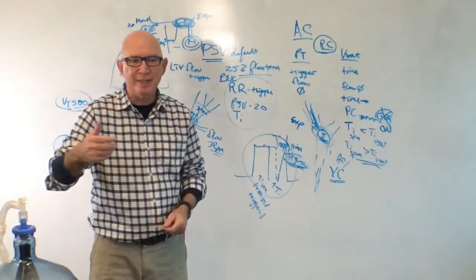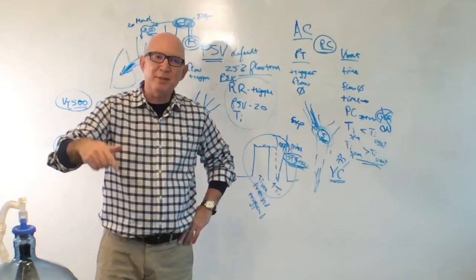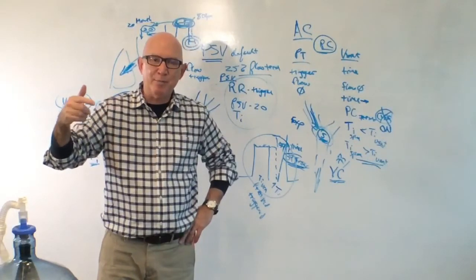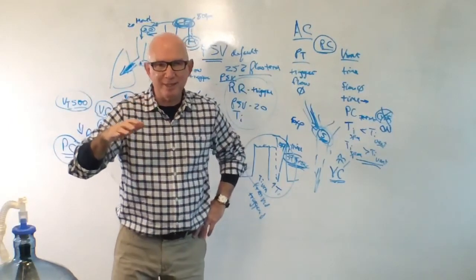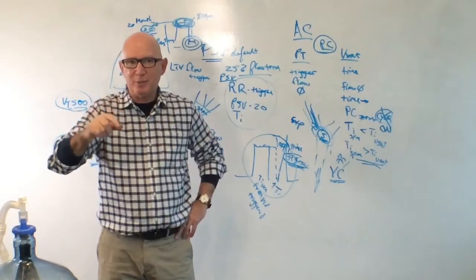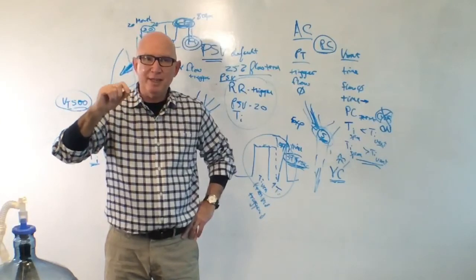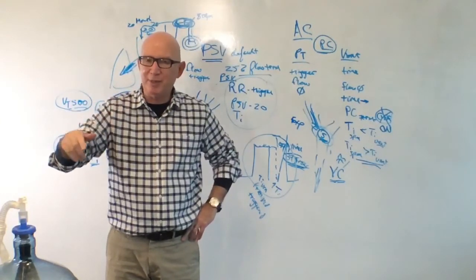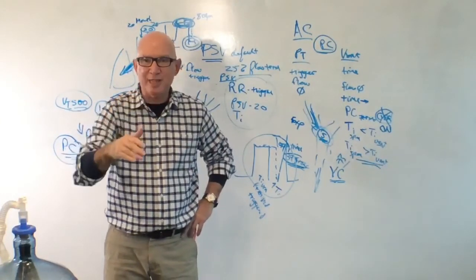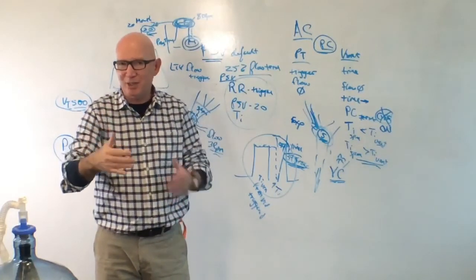So, for example, the question is then, were the tidal volumes greater than 8 mils per kilogram body weight? And so this is total body weight. That's the first question. And typically that's no. And the next question is, was the ideal body weight calculated, and is the tidal volume greater than 8 mils per kilogram ideal body weight? And for most of the time I have to answer, no, the ideal body weight was not calculated, simply because it's not in the chart.